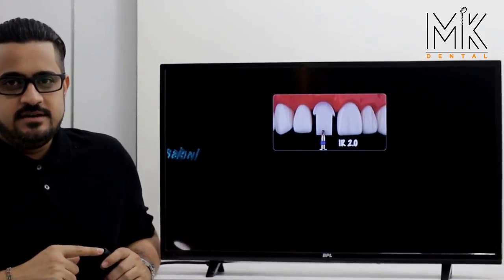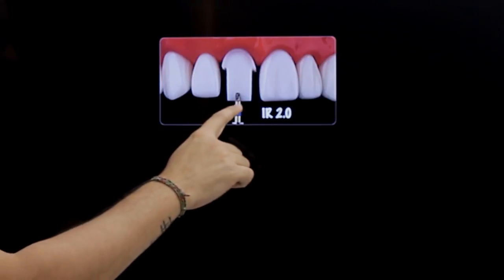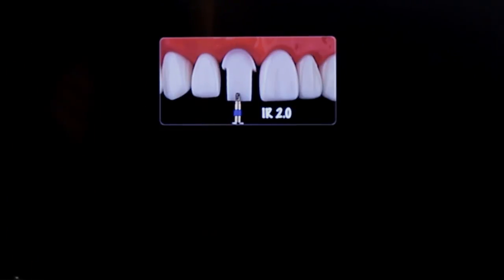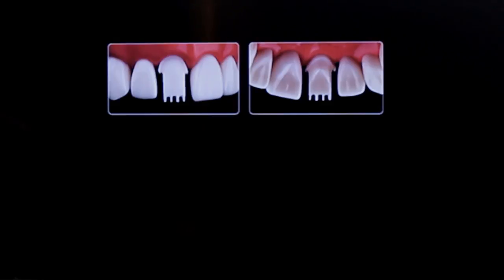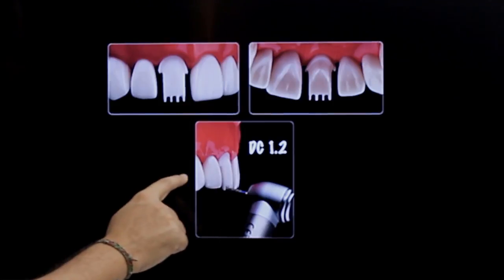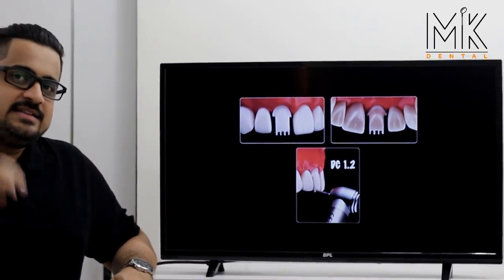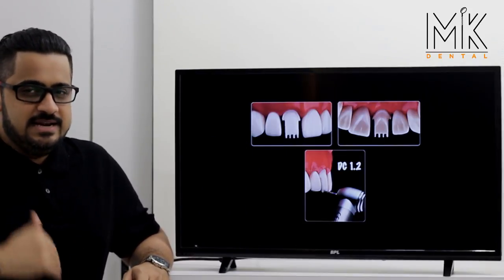To bring more predictability, we have the IR 2.0 burr — IR standing for incisal reduction. This burr has a working tip of exactly two millimeters, after which is a non-cutting area. You hold the burr and butt it against the incisal edge — it will contact the same spot repeatedly. Run the burr from the buccal through into the palatal, giving you an exact groove two millimeters tall. Make two more grooves for a total of three at two millimeter depth. Then take a long burr, angled slightly toward the palatal, and reduce the entire incisal edge to achieve exactly two millimeters of reduction.